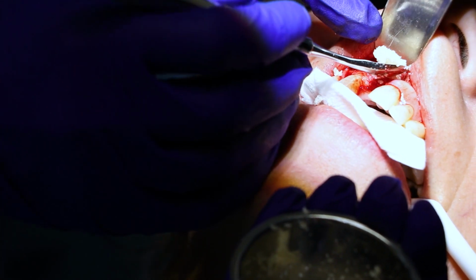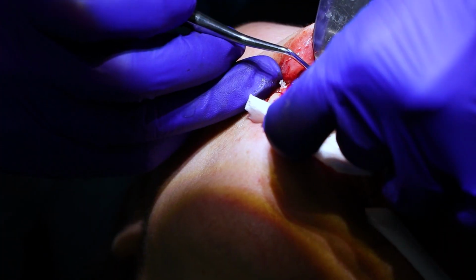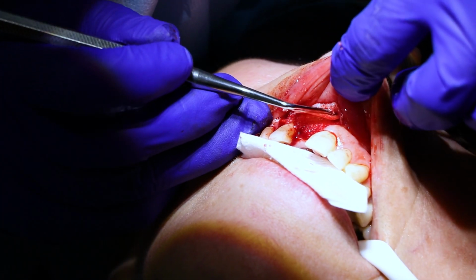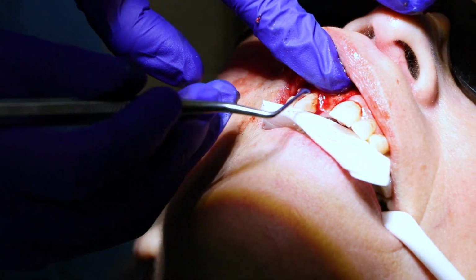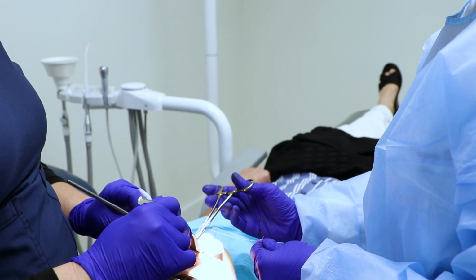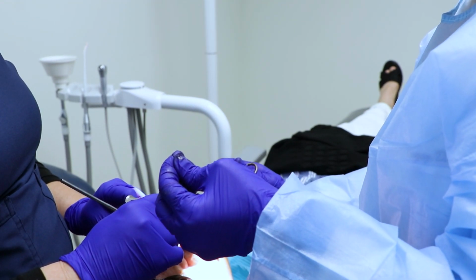Now once I have a nice and hardy ridge, then I'll slide the membrane over the bone graft, and this is a barrier membrane that won't allow the tissue to grow into the bone graft. I tuck it in on the palatal side or the lingual side, and then I suture it all together. And what I do is I use the sutures to hold the membrane in place and keep the bone graft in place.